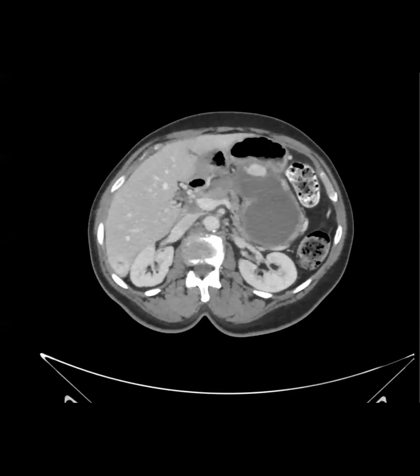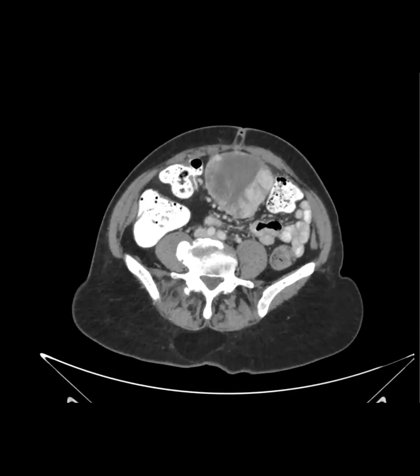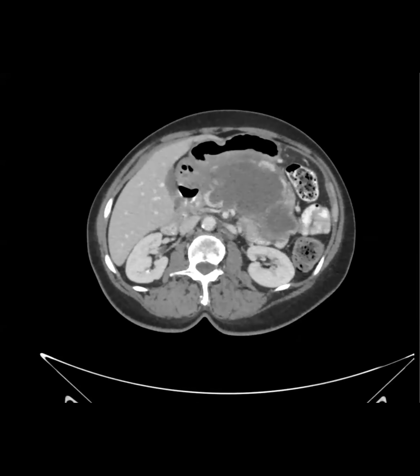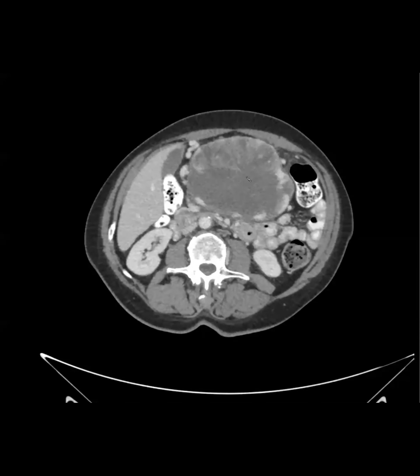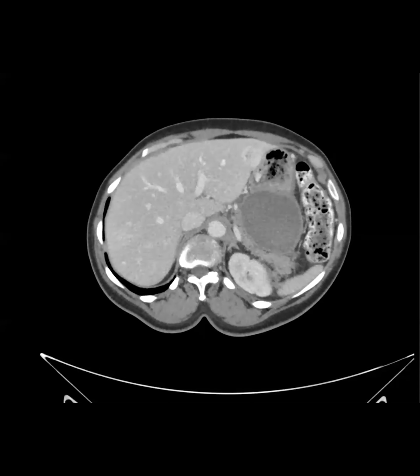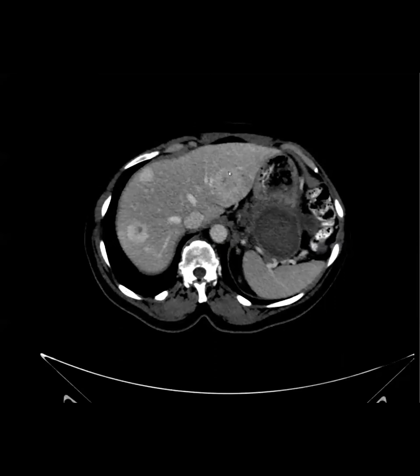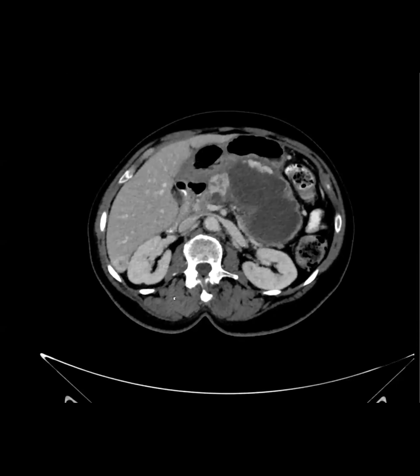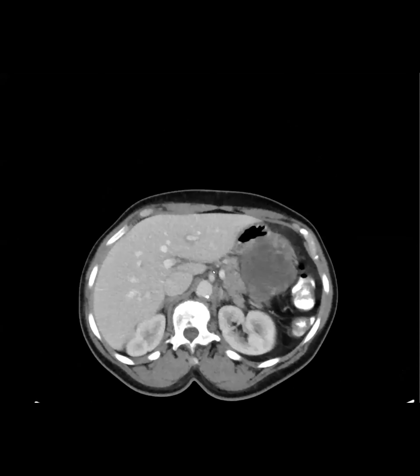And then I just thought this was interesting because I saw this case and I was like, oh, is this an acinar cell? But it does look a little different. The kind of periphery enhancing component isn't as papillary looking. But anyway, this turned out to be a GIST. You can see they have a lot of liver mets for this GIST. So they treated this patient with Gleevec, and this was their follow-up scan.